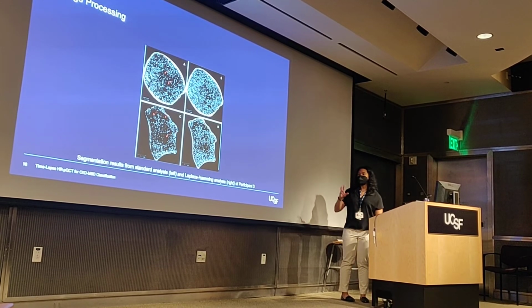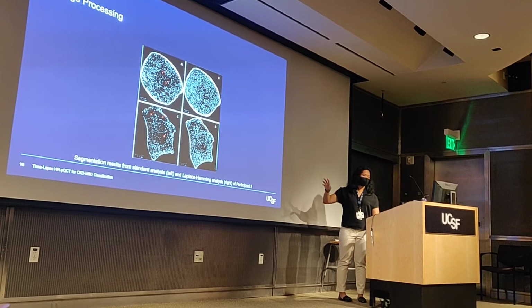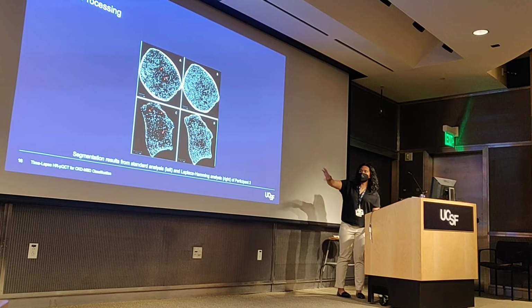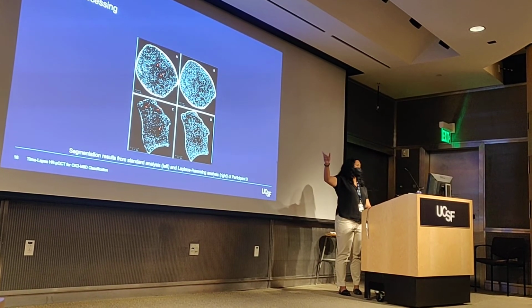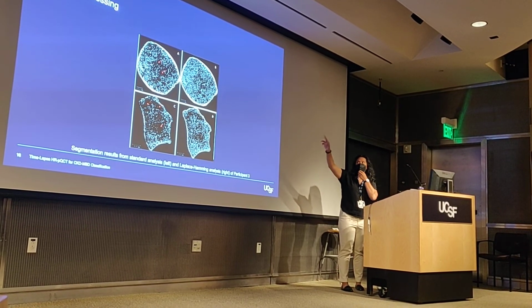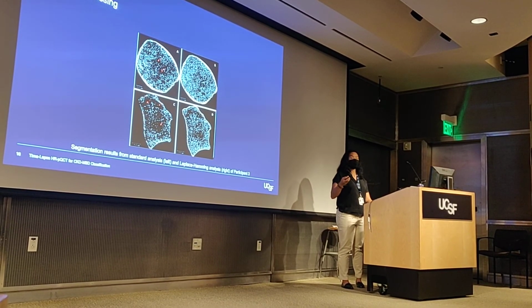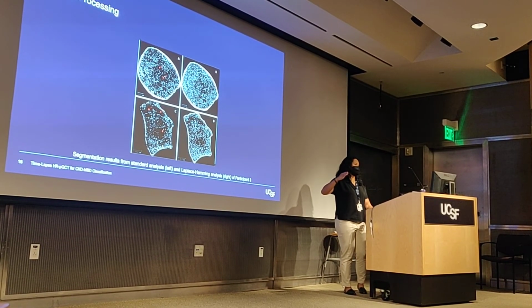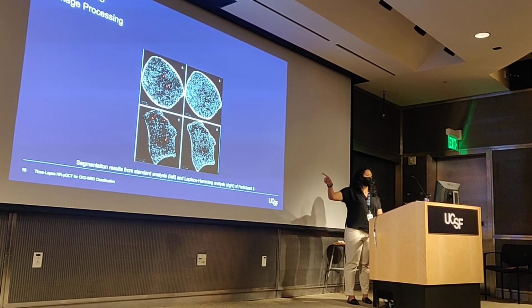On the left is the standard analysis, and on the right is the Laplace-Hamming analysis. It's pretty clear, but I also denoted it with some red arrows, that using the standard analysis, there's area in the trabecular bone where bone isn't identified. Similarly, looking at the cortex, or that bright outer edge of bone, there are a lot larger cortical pores. And in some cases, specifically with image C, there are even some breaks in the cortex. All of that seems to be addressed when running the images through the Laplace-Hamming technique.